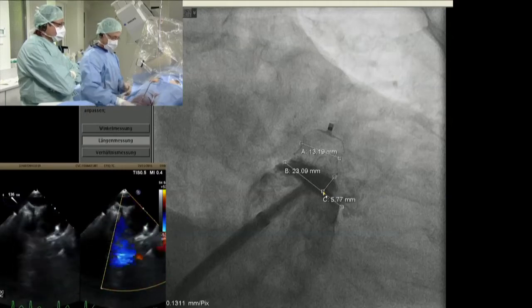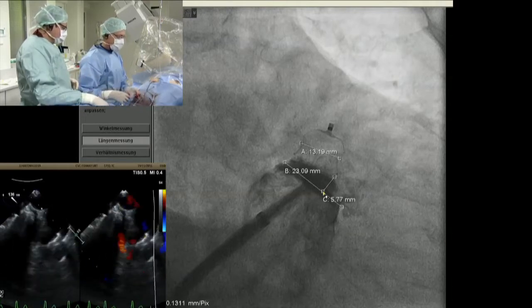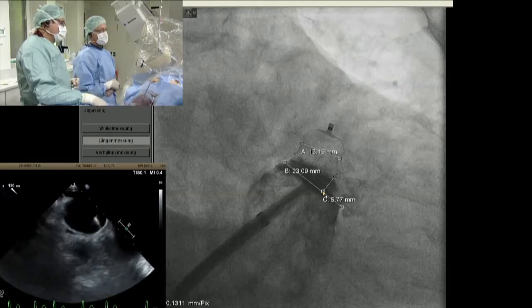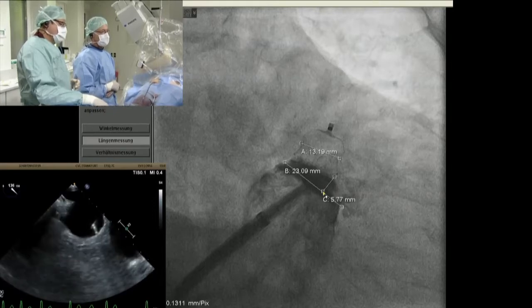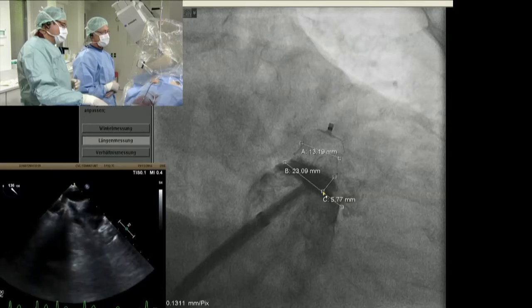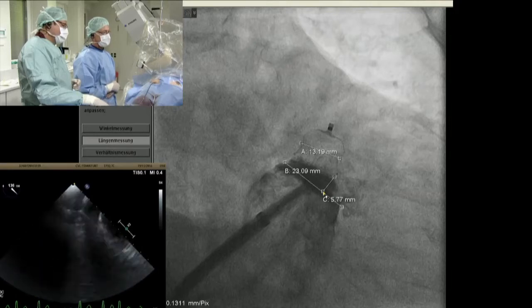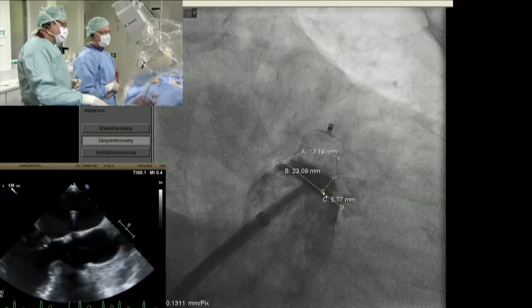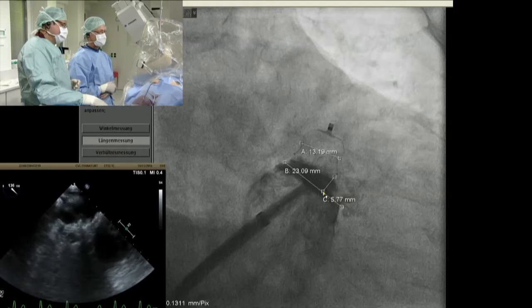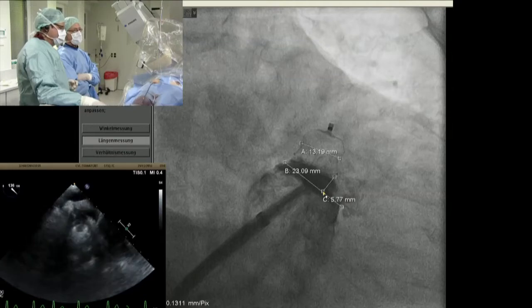So maybe a 1630 Lambre. Yeah. Which one? Sorry. 1630. Okay. So not the 1532 then, which is the one you suggested before. 1832 might be okay, but we only got 13 millimeter when that compressed. So you want the 1532, the 1432, or the 1832? No, I think they're all even numbers. But we're not sure. Okay, so what do you think then?